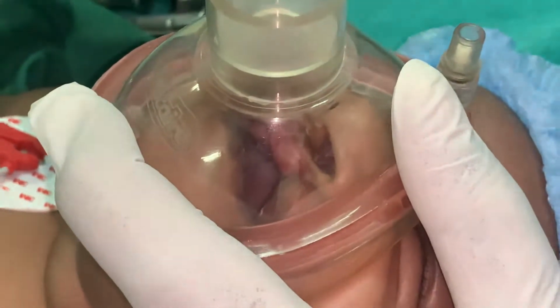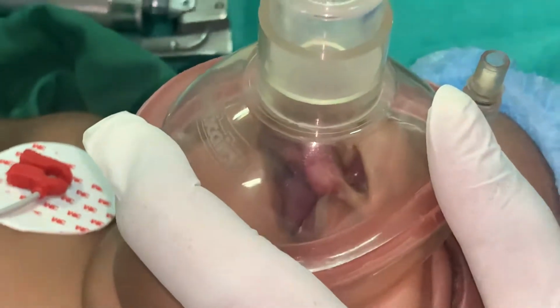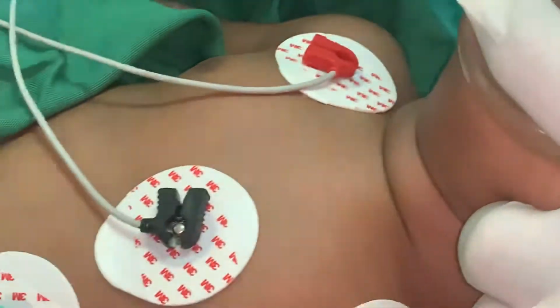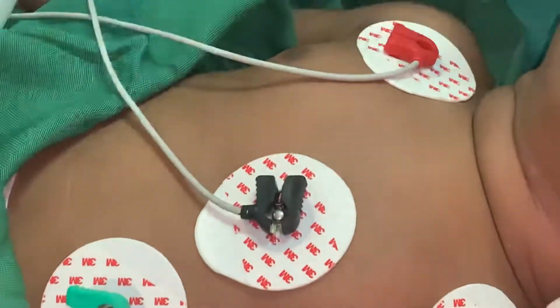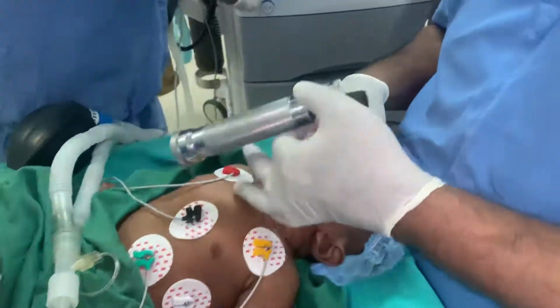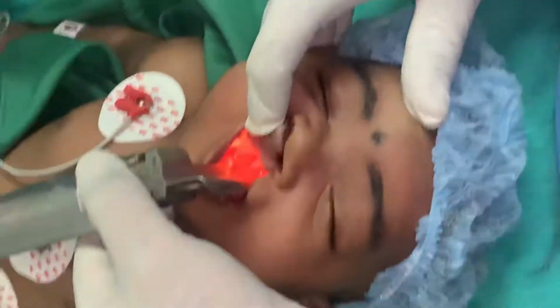So getting a view of the cleft kid through the mask. Okay. Base chest leads. Palate and cleft.